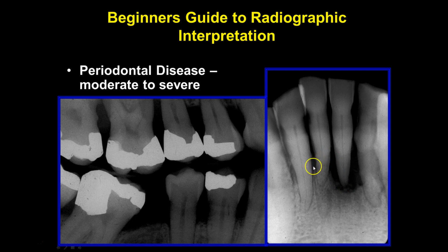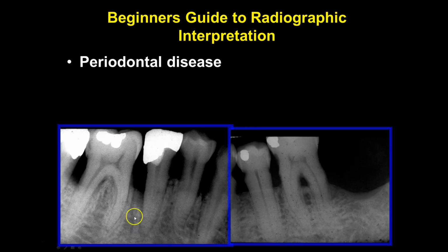And you know, we know that the prognosis is not very positive for this tooth. We would want the doctor to evaluate to make sure that this would more than likely be referred to a periodontist to evaluate for root fracture, and or if there's any other anomalies that are going on, to see if there was any way to regenerate the growth of this bone. Mesial migration causing some periodontal issues there.